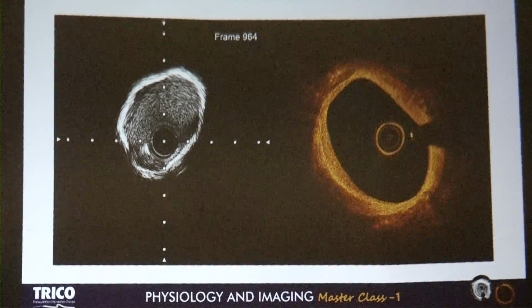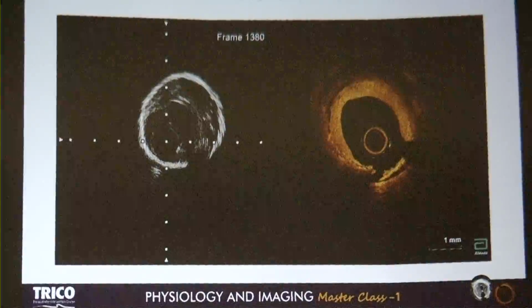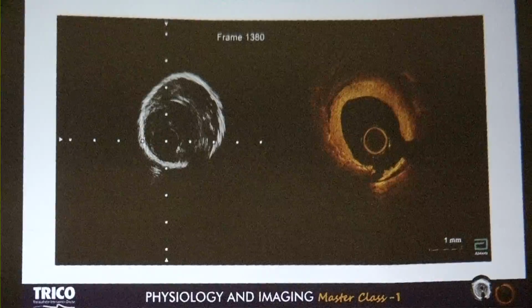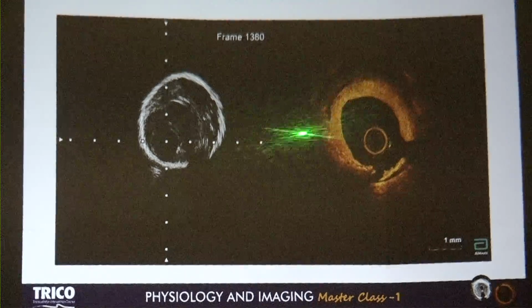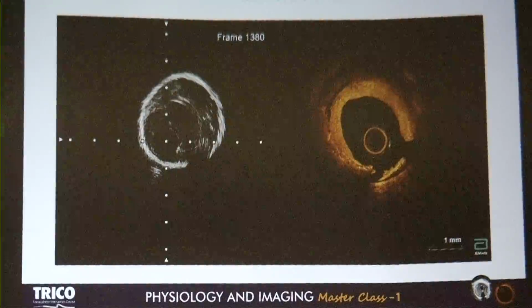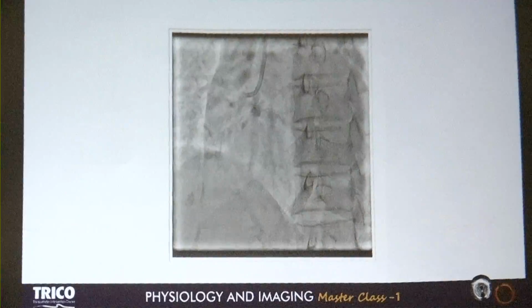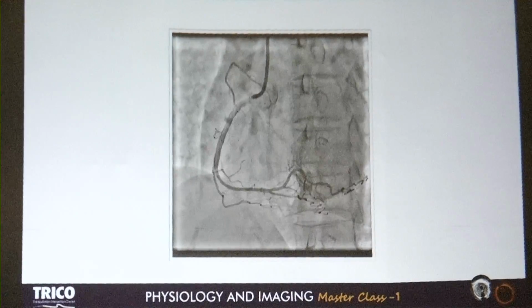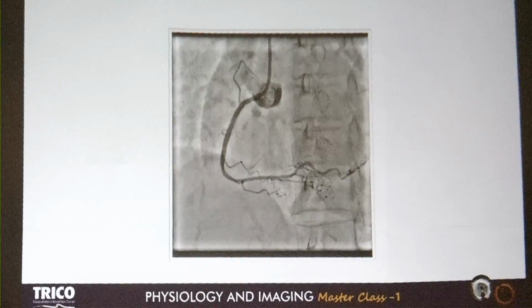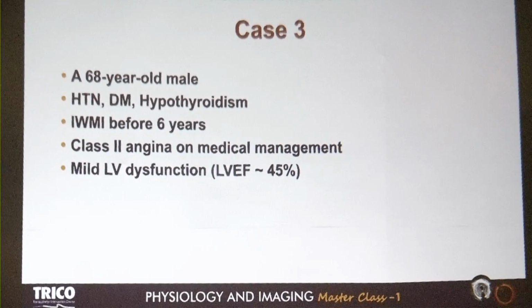Yes. So this is, again, a puzzle, and this is after post dilatation. This area after dilatation, the same images, 1 to 1. Some hematoma here, and this is broken. And this is the stent result. So sometimes I feel that both the modalities are complementary to each other.